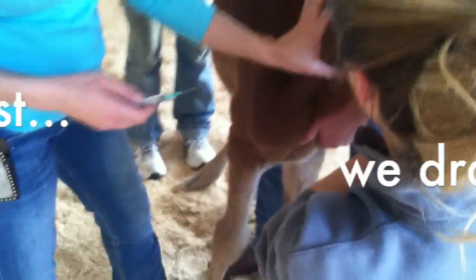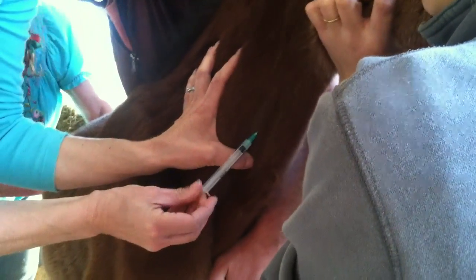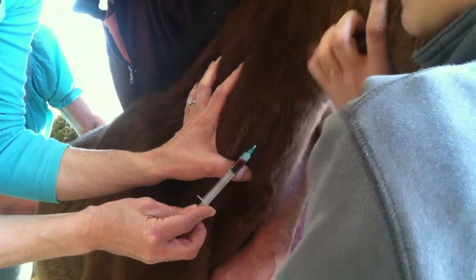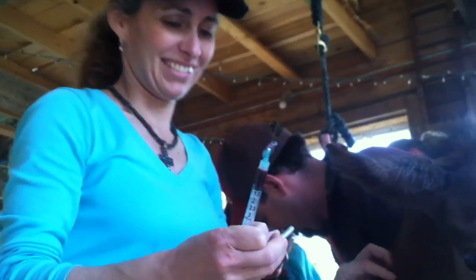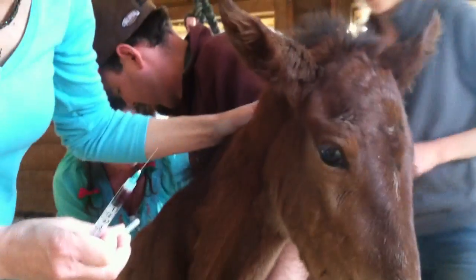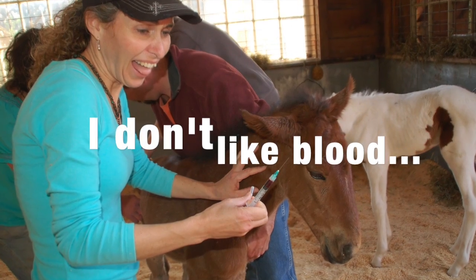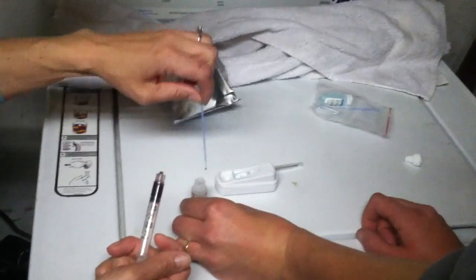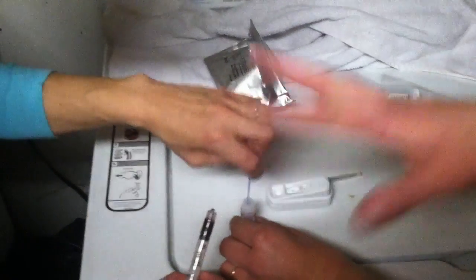You're going to be amazed how much a little tiny newborn can — oh my gosh, did you get it? She got it! That's plenty, yeah. That's enough. Feel this right here, down here. I got you. That face — poor baby, I'm sorry. It's for your good. Mom, look at your face. That was a lot of blood. Okay, swirl it in there, swirl it. Yep, okay.